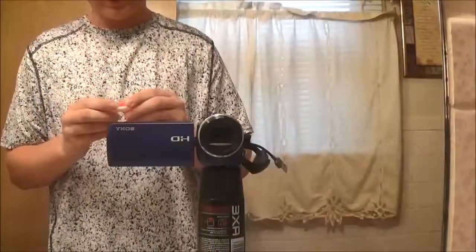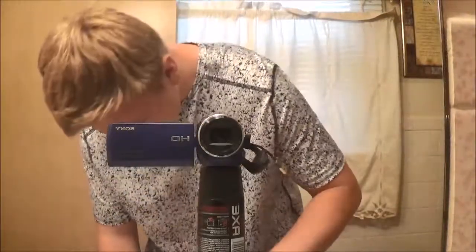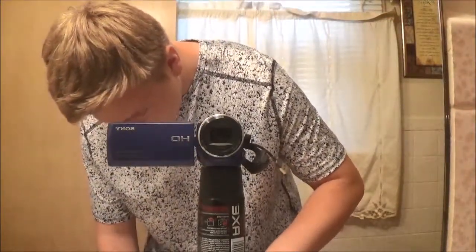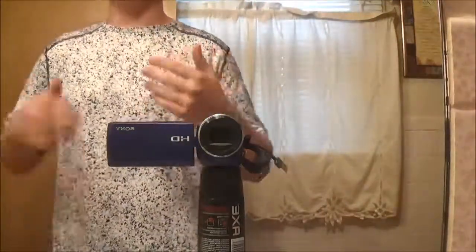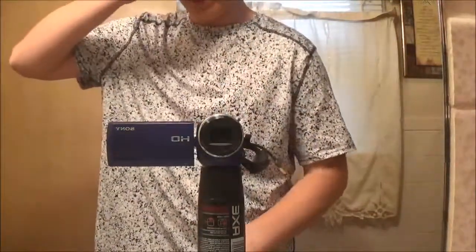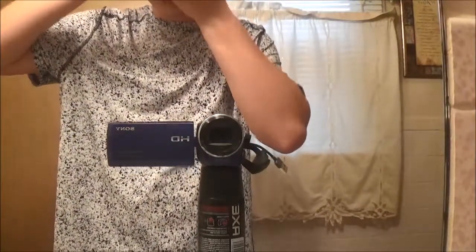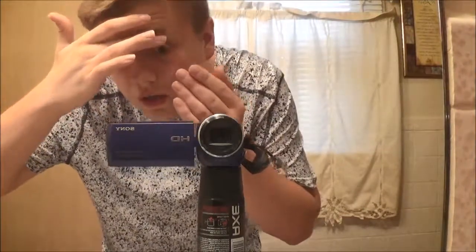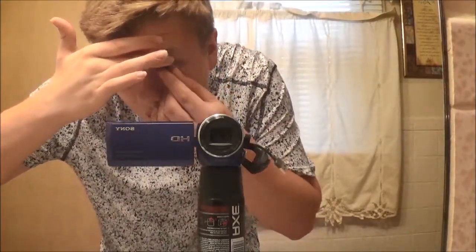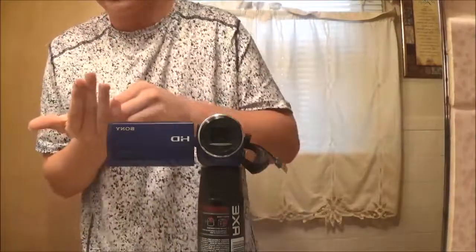So now we still got the right contact on. It looks blurry and weird now, since there's only one contact. Same process, fill it halfway up. This kind of just soaks it in before you actually fill it up. So you want to fill it halfway up with the solution that you have, not saline, because it's a different type of contact. I should get in the camera to show you guys. So, up, down, each side of the color of your eye, pinch, right is out.